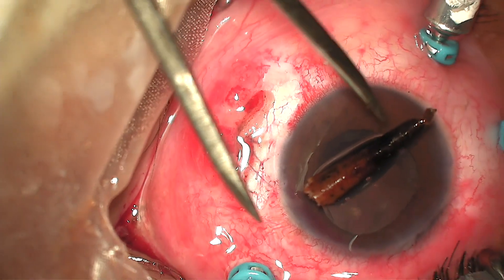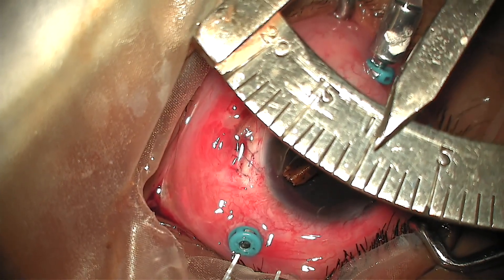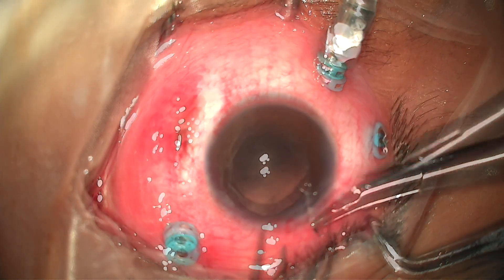The foreign body removed was a dead palm thorn measuring 9.5 mm in length. The main port was then sutured with 10-0 nylon.